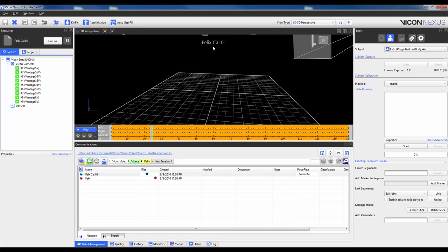From here you actually have to make a choice. You can process the Static Trial now or immediately begin capturing Dynamic Trials by clicking Go Live. If you wait to process the Static Trial, there's a good chance that the real-time labeling will not be reliable. As such, I will show you the workflow for processing the Static Trial before capturing any Dynamic Trials.